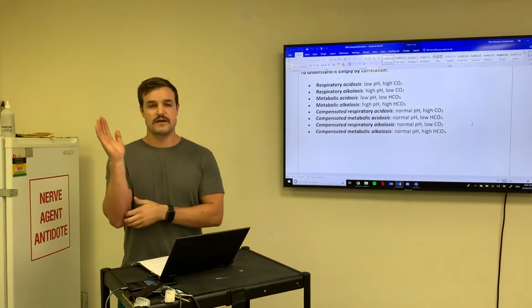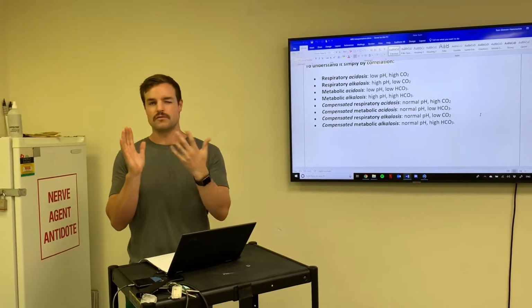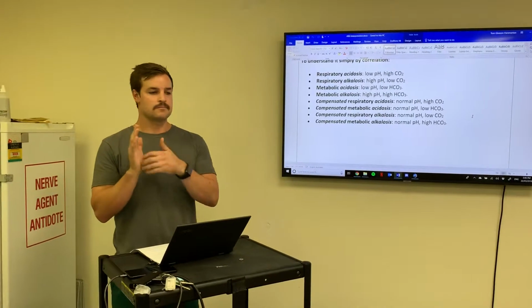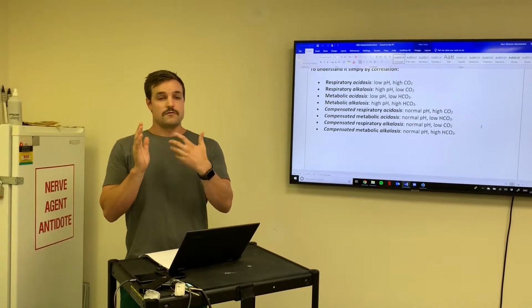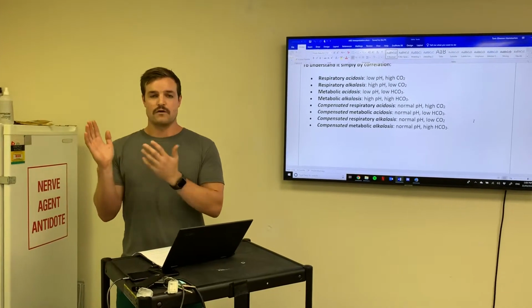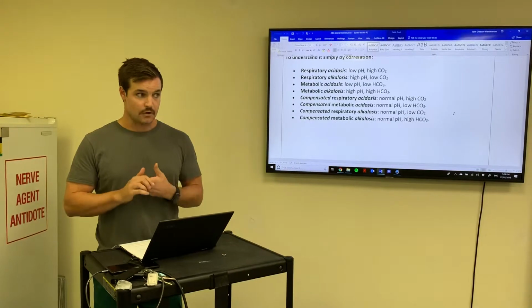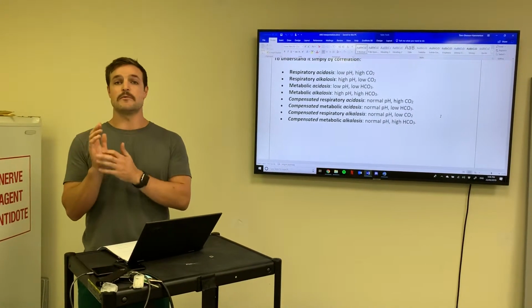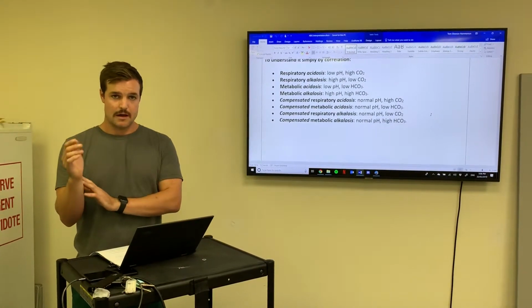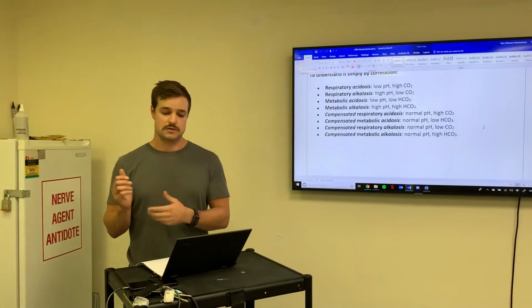What you're testing is that blood is going from the ulnar artery back into the hand. If you reperfuse within 5 to 15 seconds, you've got good perfusion and good blood feeding through the ulnar artery, which means you can go for your radial artery for arterial blood gas. If you get an abnormal modified Allen's test and you don't get perfusion properly through your ulnar artery, then you shouldn't go for the radial artery, because that's the primary source of the hand's perfusion.